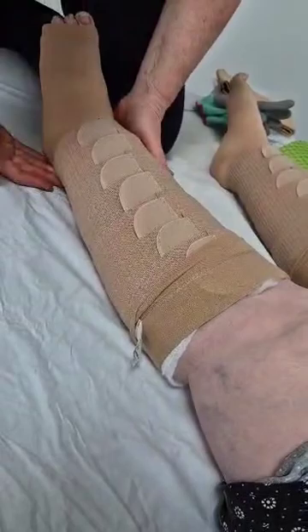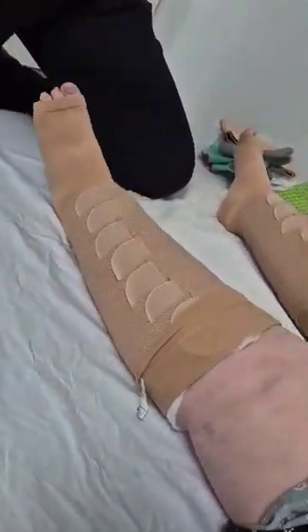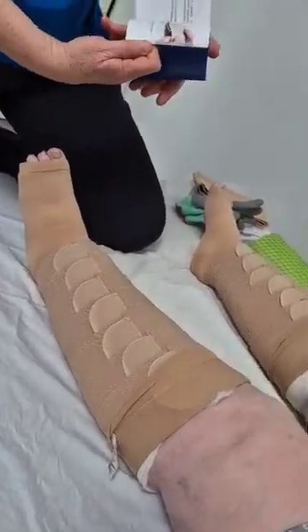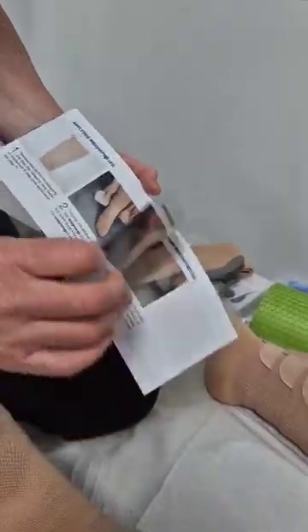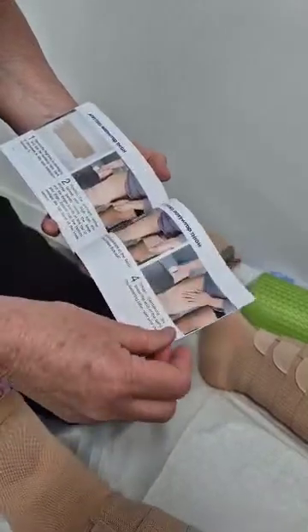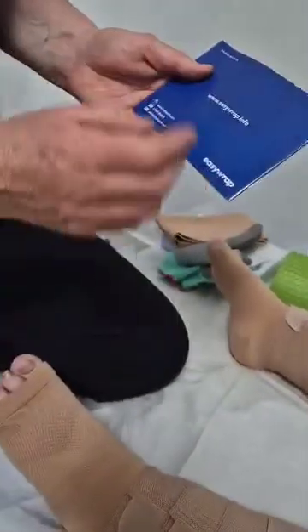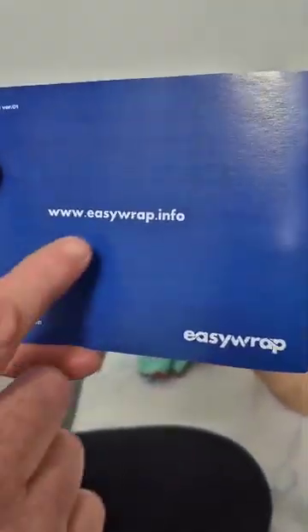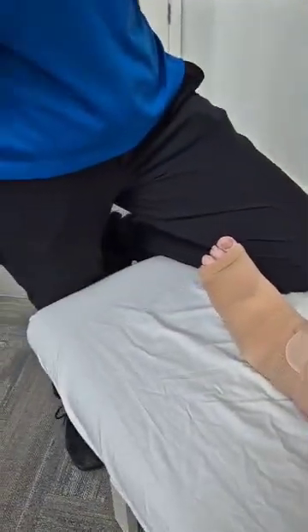Yep. Thank you. And that feels quite good. Now, there are instructions on how to use them in here, and they have a whole lot of different garments. So they have a foot wrap, which we're not using because we're using the hybrid liner instead. They've got a knee part, but we're just doing the leg. Anyway, it's in here. And there's also a website that you can go to for videos as well. Okay, great, cool.